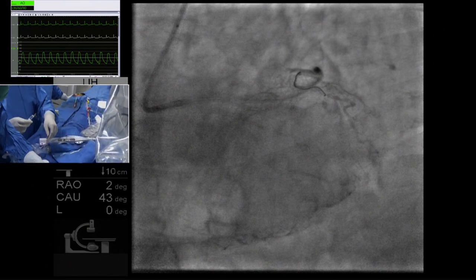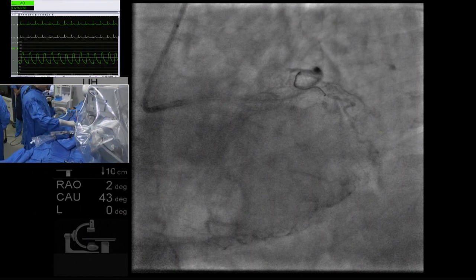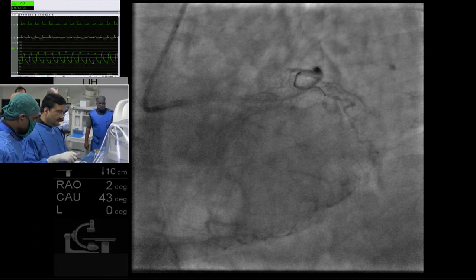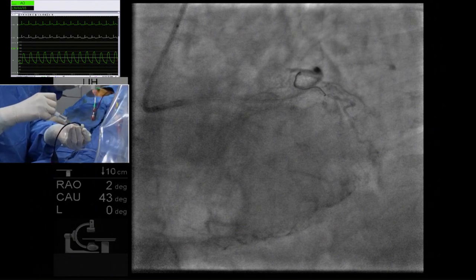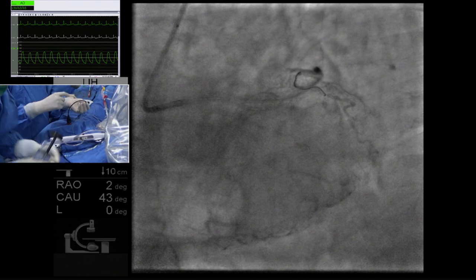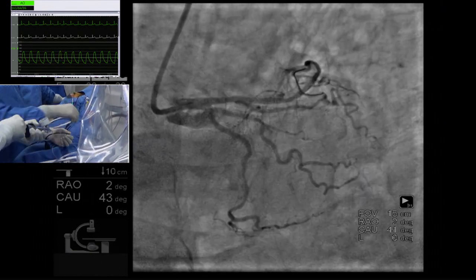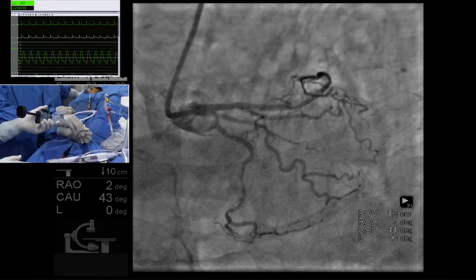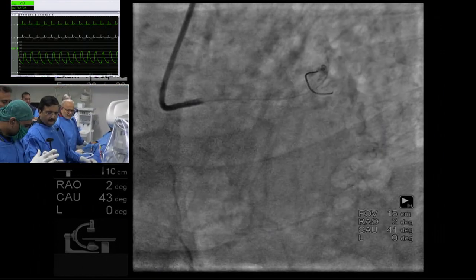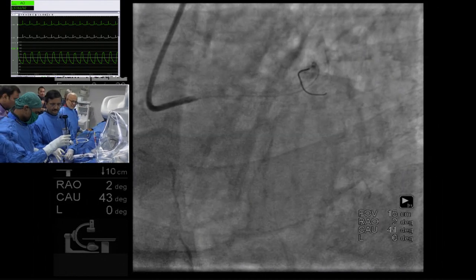Internal IVL, how do you size the balloon, TJ? This vessel, initially it looked to me even lesser than 2.5, but after doing preparation, it is around 2.5. So I don't oversize the IVL balloon. I will try to keep it as near to the vessel size as possible. 1:1. And here you have to make sure you aspirate that balloon very well, so there's no possibility of bubbles, so you can transmit the energy. Exactly. Yes, that is exactly what is being done. Bubble and IVL, it does not work well, right? You've got to make sure you aspirate well.